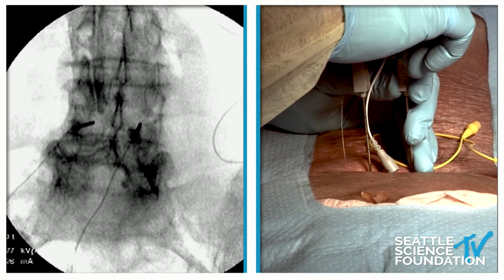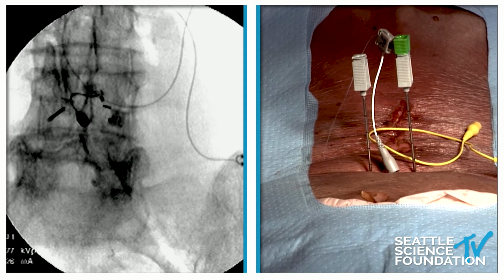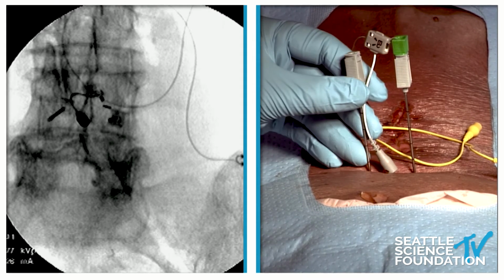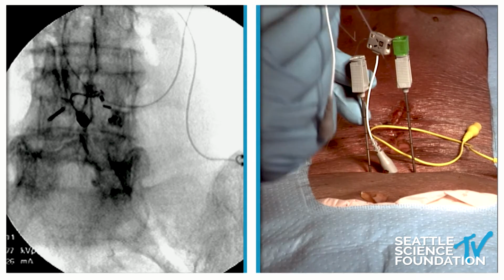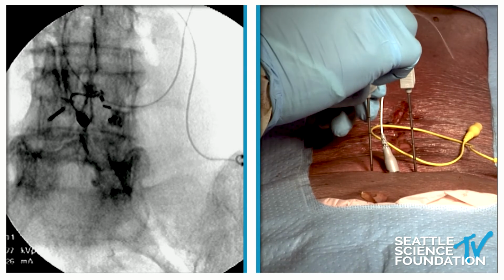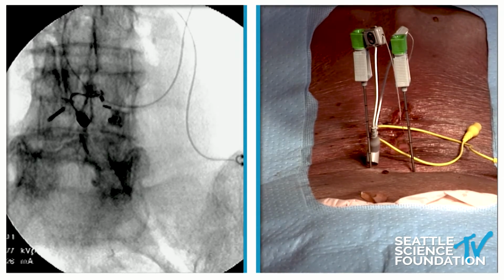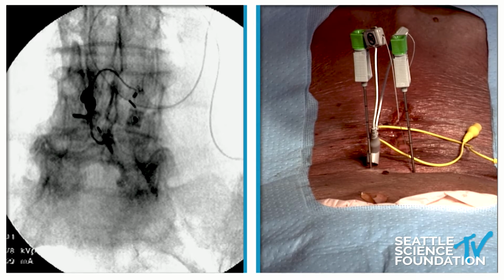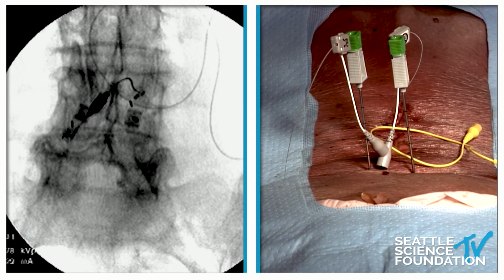again, I just want to make sure everything looks good, and then I'll rotate it in place. I'll take a picture just to make sure my tips still look like they're in good position. It looks great as far as the right one. The left one, I can just make a little adjustment. I'll throw that down. Perfect. Again, we've done a great job here with lining that tine up. We'll just move everything out of the way here. Beautiful. And we'll just take a peek here. So a little bit lateral on that left one. I'm just going to make a slight angulation adjustment. Okay, so there we go. Looks good. You can see both under coaxial view.